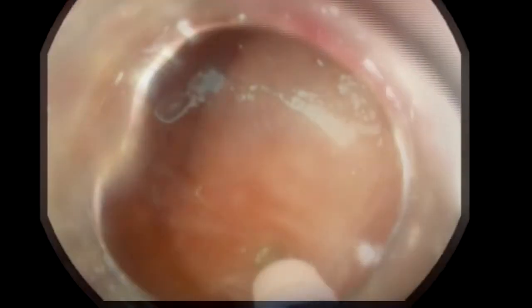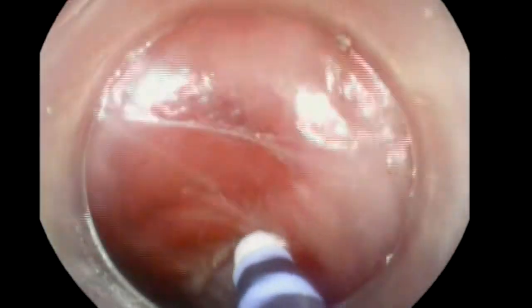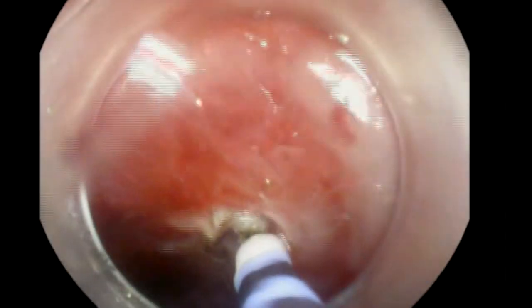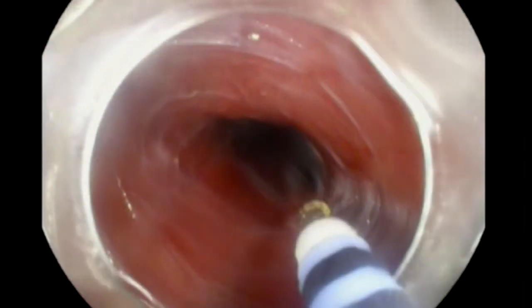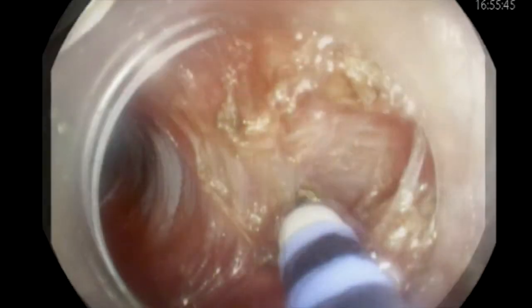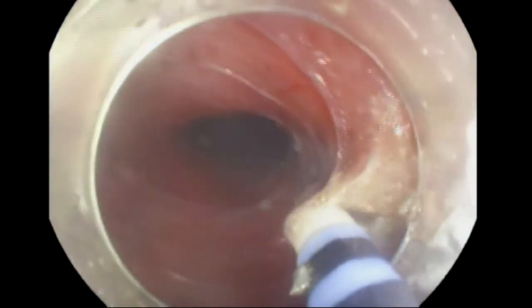And now we finish the tunnel. In retroflexion, we can see the tunnel is extended to the lesser curvature of the stomach. Creating the myotomy, there are two ways of doing it. You can do a full thickness cut. I prefer to do only cutting of the circular muscle and leave the longitudinal muscle in place. In theory, that can decrease the risk of reflux. So, you will cut initially the circular muscle until we find the plane between the longitudinal and circular muscle.